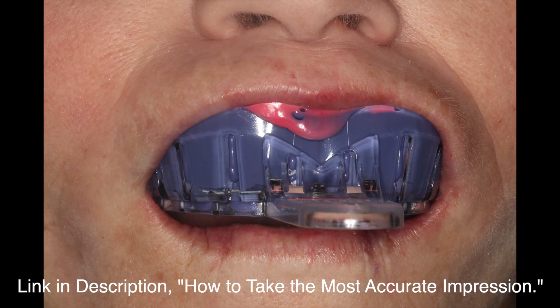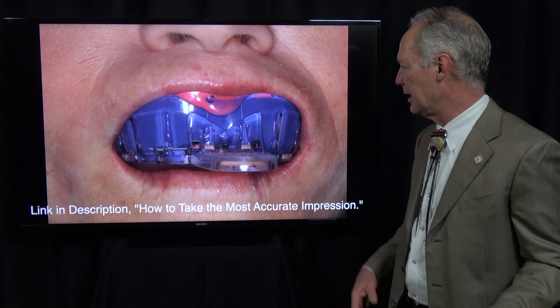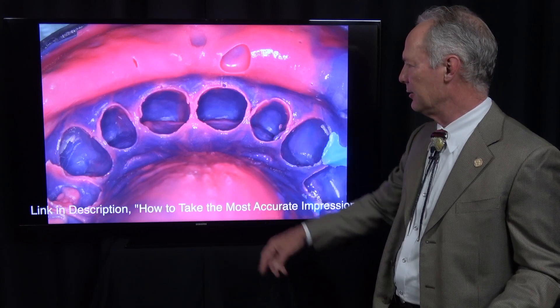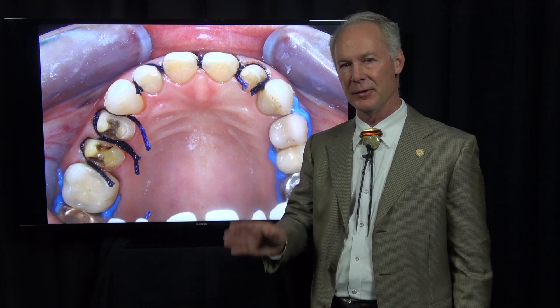Then we put it in place. You can refer to the video on how to take the most accurate impressions — this one is on cord placement so we're not going into that. This is a deadly accurate impression material: polyether. So that's the Dental Minute. These techniques work and they work every time.